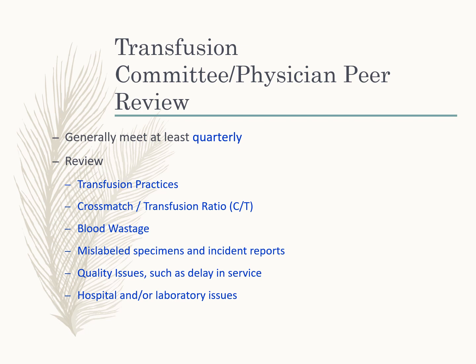So the purpose of this committee, they must meet at least quarterly, and they want to review everything related to transfusion. So the transfusion practices, the cross-match to transfusion ratio. So you want to know, are you cross-matching 100 units and only 2 get transfused? So that's a lot of extra work for the blood bank. What kind of blood wastage? Like, are the nurses picking up the units and then they're sitting on the floor and not getting transfused, and then they have to be discarded because there's always blood shortages. So we really, really want to be good stewards of the blood supply.